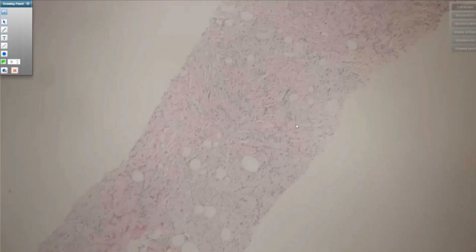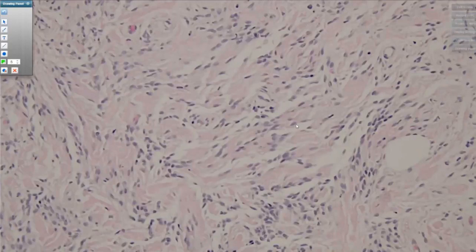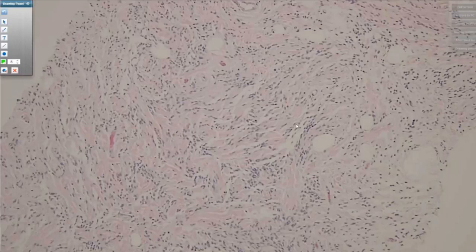So now we're in between a differential of an epithelioid neoplasm and a spindle cell neoplasm. Just to reiterate, differential diagnosis of these bland spindle cell proliferations: first and foremost need to exclude metaplastic carcinoma, then consider fibromatosis, myofibroblastoma, and other less common entities like the nerve sheath tumors, nodular fasciitis, and sampling of a stromal component of a phyllodes tumor.